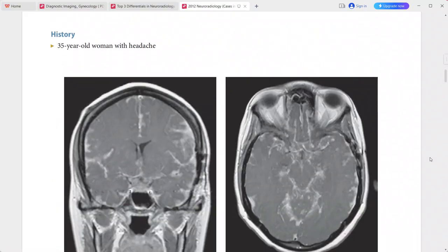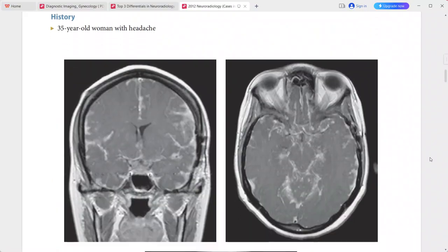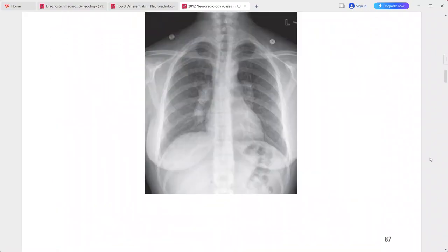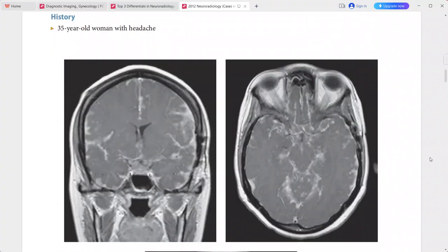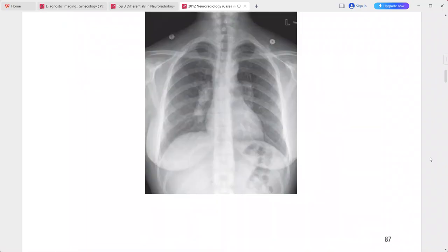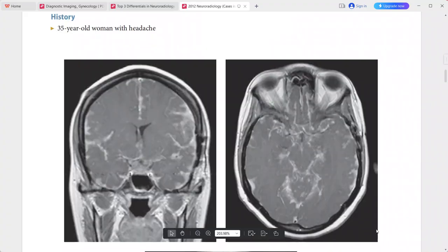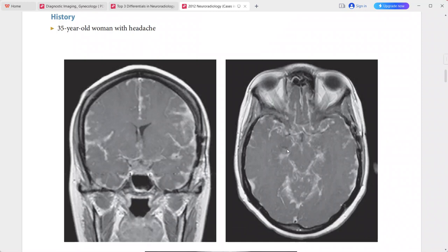Next: a 35-year-old woman presenting with headache, with chest X-ray also provided. Post-contrast T1-weighted MRI shows thick nodular leptomeningeal enhancement most prominent along the sylvian fissures and basal cisterns.